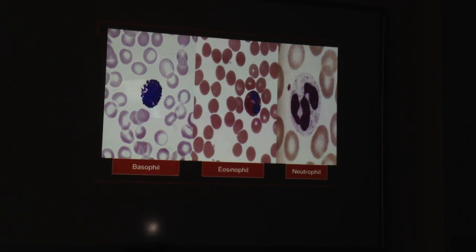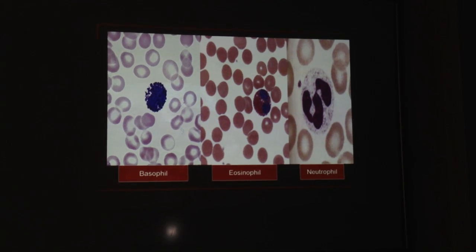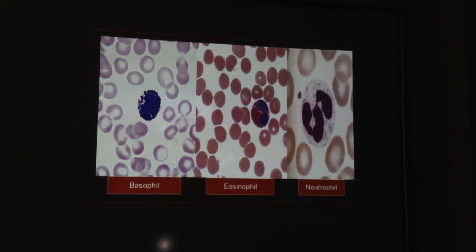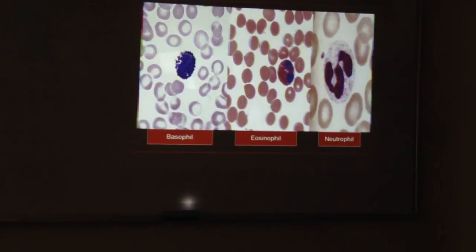You can see these three cells. Neutrophil size is not so large in the actual slide. You have seen this. It's almost the same as eosinophil or basophil. You can see the difference in granules. Pinkish blue granules in neutrophil, thick red granules in eosinophil.